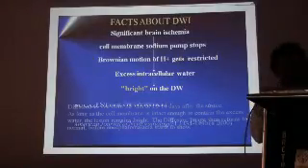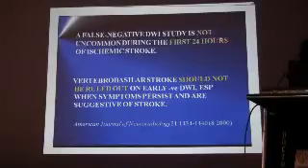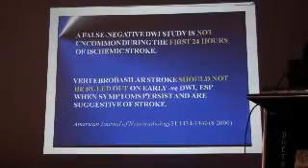Okay? Now, a false negative diffusion is not uncommon during the first 24 hours of ischemic stroke. So these are the problems. Again, vertebrobasilar insufficiency should not be ruled out early if diffusion is negative, especially when symptoms persist and are suggestive of stroke.